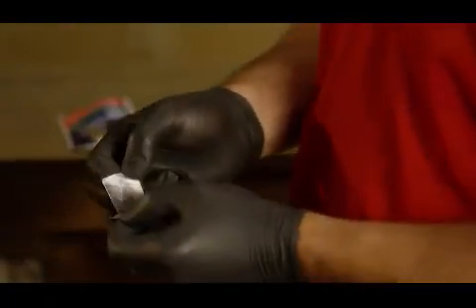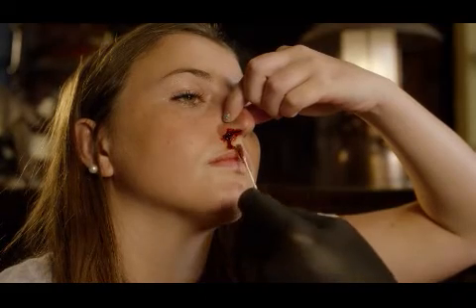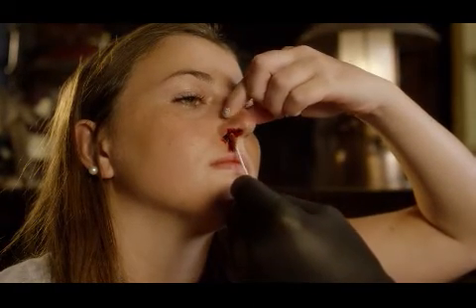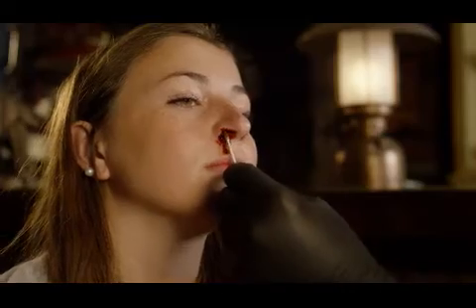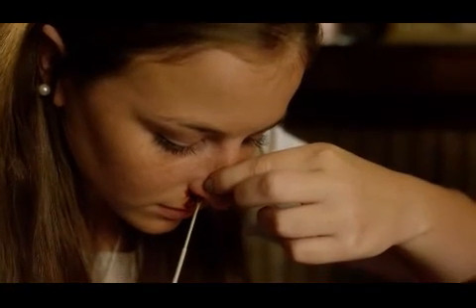This teardrop package — open up, dip the powder, it'll stick to it, and then we can insert it in the nose. This is going to go in your nose. Unpinch, pinch, and lean forward. Chin to your chest. There you go.